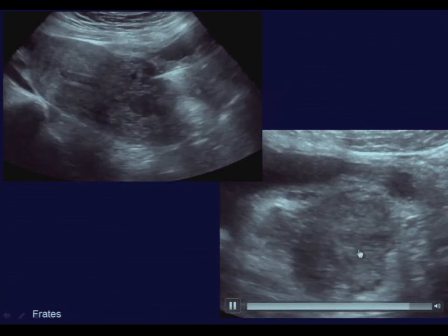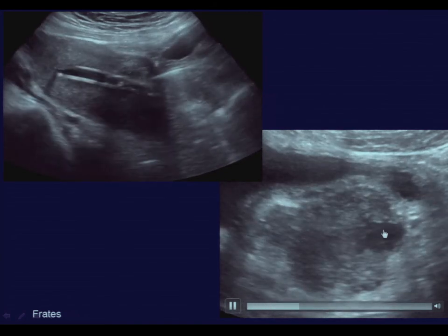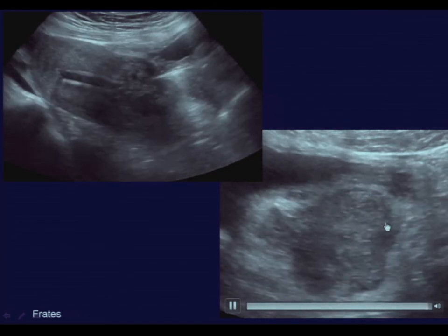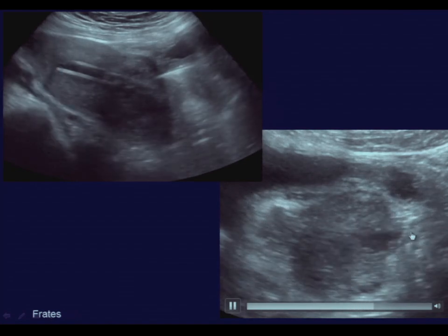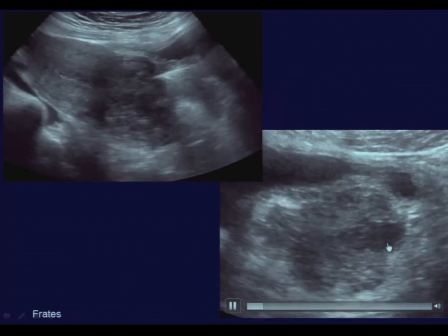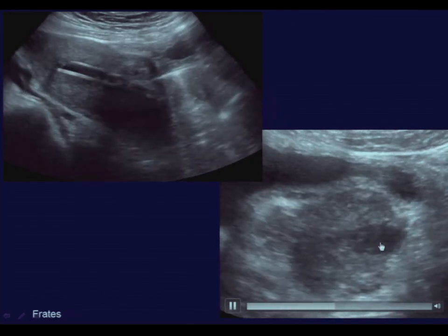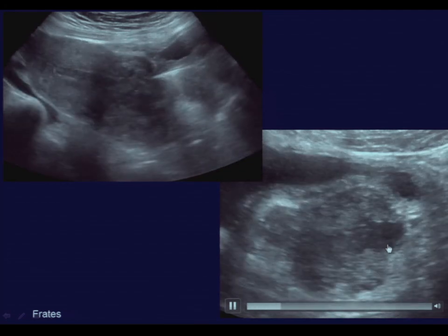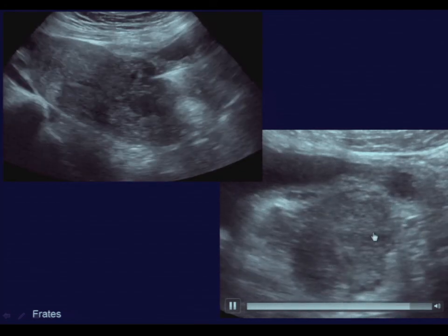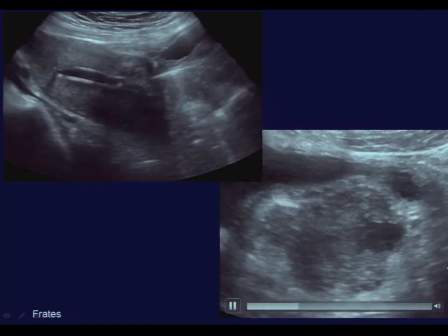So the catheter was removed and a Bakri balloon was placed to tamponade this presumed uterine rupture where the C-section implantation had occurred. And this patient actually did quite well. After 24 hours, the balloon was removed. She stopped bleeding, and eventually the uterus did heal itself down in the region of the C-section scar.